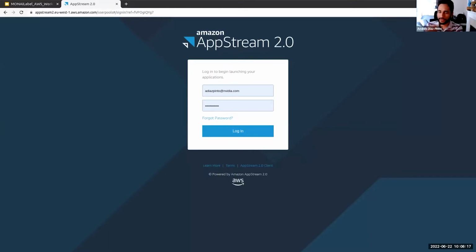Okay, I can show you that briefly once we finish the demo. Yeah, I can show that it's actually very easy and very interesting. In the beginning it's a bit difficult because you need to consider a couple of things, but I'll show you the things that you need to pay attention to, and it should be easy to modify the user interface. Okay, awesome, thanks. If you remind me, please, to do that, because I don't want to forget. Yeah, I'll try to remind you. I have it here on our Q&A list, so if we have time after, we can make sure to go into that. Excellent, very good.